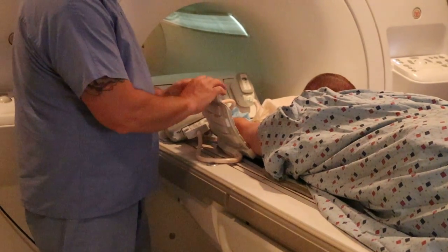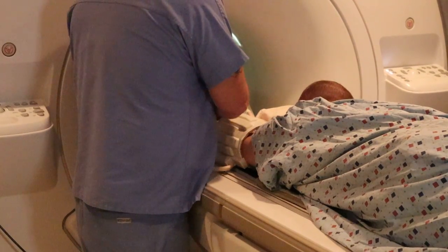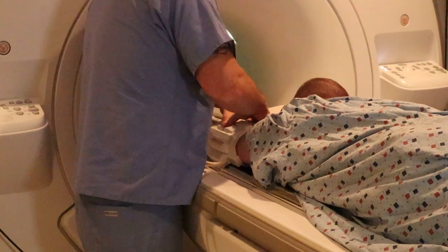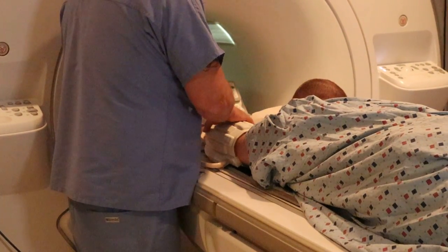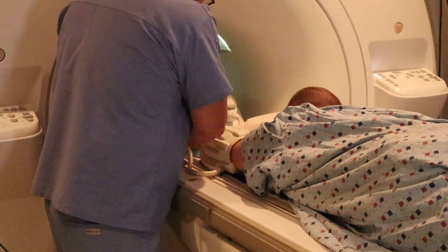Remember black to black to confirm parallel imaging. And you want the whole arm in plane.